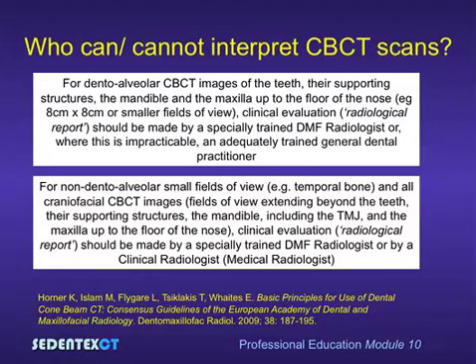But in the Sedentex CT project, a definition of what was suitable for an adequately trained general dental practitioner to report was made. In the basic principles for the use of dental cone beam CT, the consensus guidelines of the European Academy of Dental and Maxillofacial Radiology from 2009, two statements were agreed.